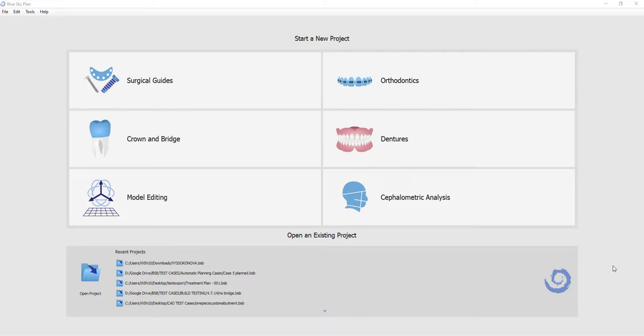The model alignment functionality properly orients the models in space, improving visibility, functionality, and aligning the models to a grid.